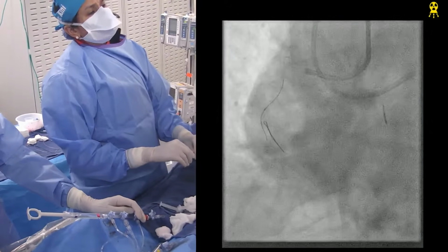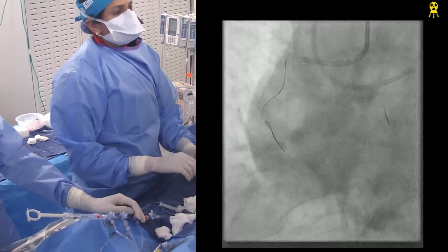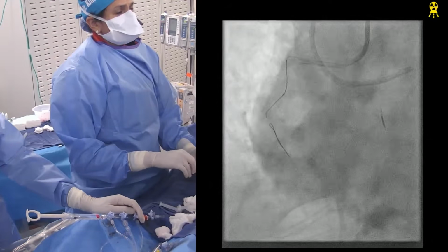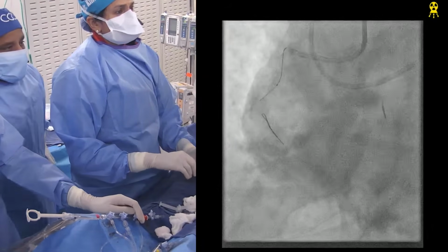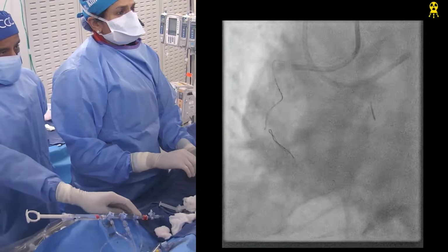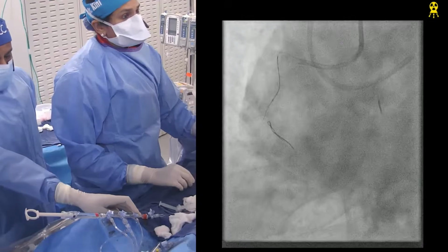Do you have the slide of the body of the wires? You can give me the various kinds of inner core. It's not helping at all.